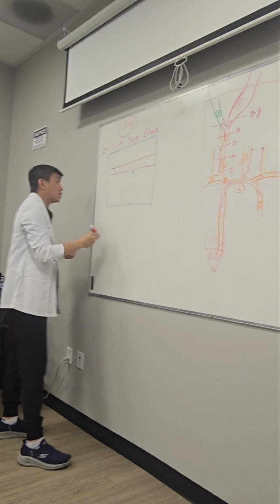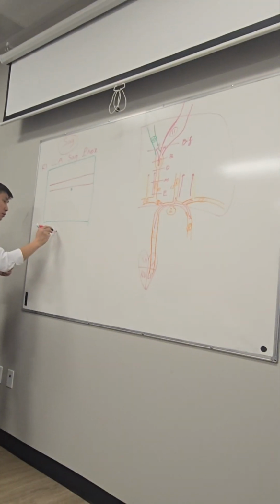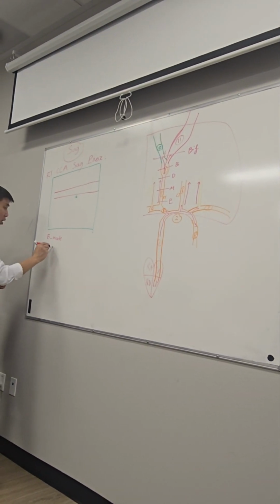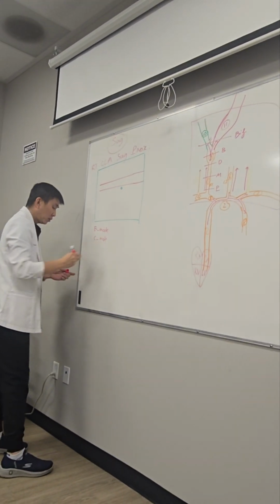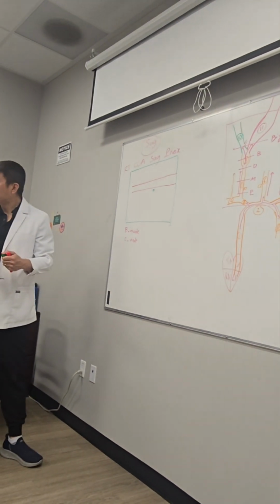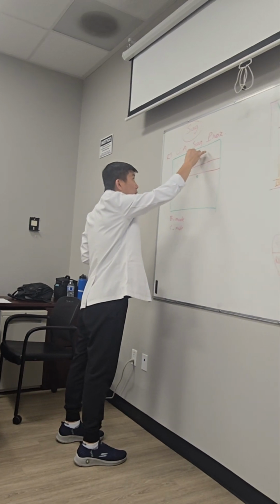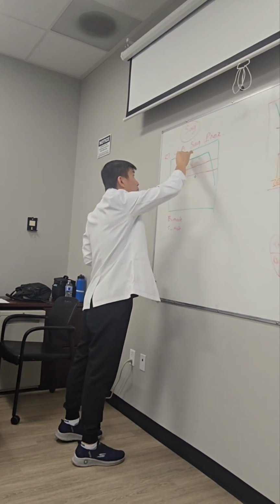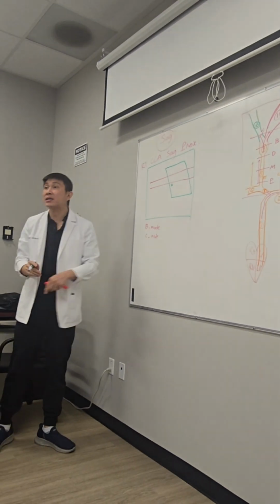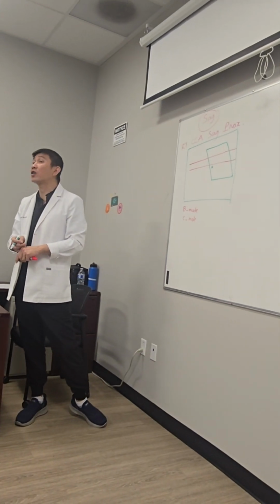Alright, so you open this one for the CCA. You're gonna take the picture, B mode. And then you turn the color on for the color mode. For the color mode, you need to use the angle steer to steer the box. This one. And the color inside is going to be red.